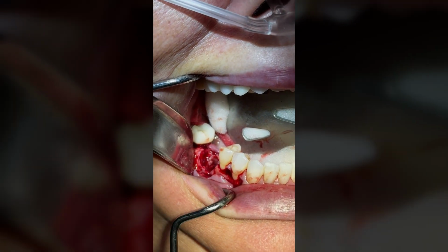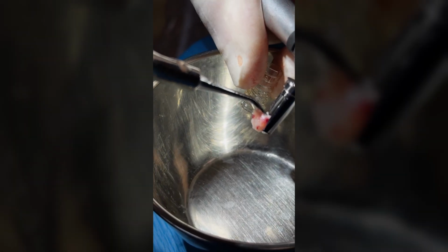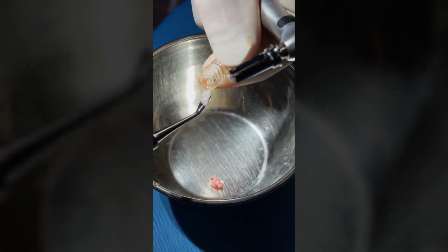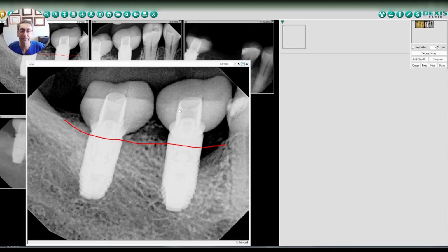As you can see, the implant is out. Now what we're dealing with is a large bony defect and tons of infection. So the most important part is decortication through the debridement. We use a spoon-shaped curette, clean everything out, lots of irrigation. We also use an erbium chromium laser for decortication, to open up the bone marrow, create bleeding, and disinfect, making sure everything is out. It's very, very important that we get all the infection out of there.